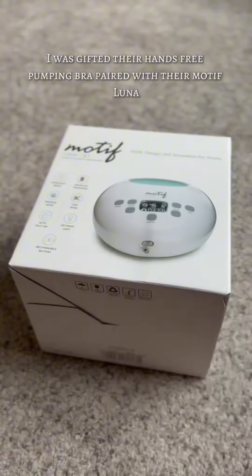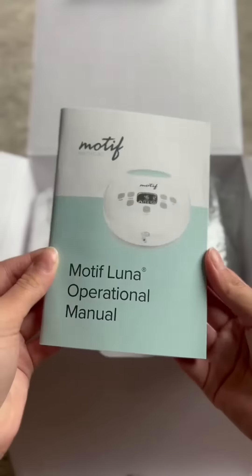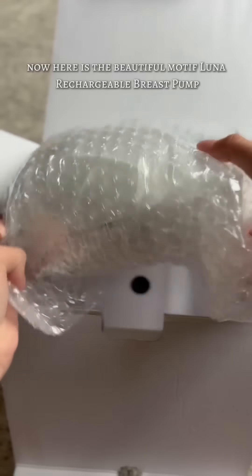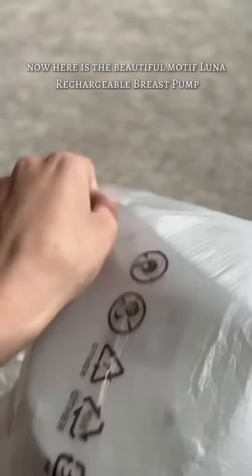I was gifted their hands-free pumping bra paired with their Motif Luna. The Luna is lightweight and has a super quiet motor. In the manual, you can learn a little bit more about it. Now here is the beautiful Motif Luna Rechargeable Breast Pump.